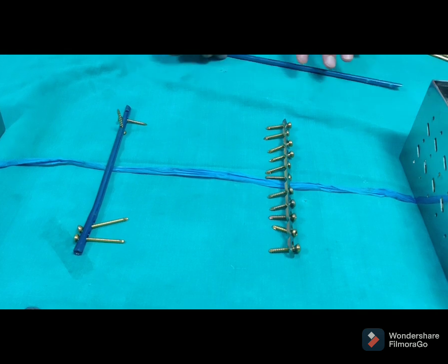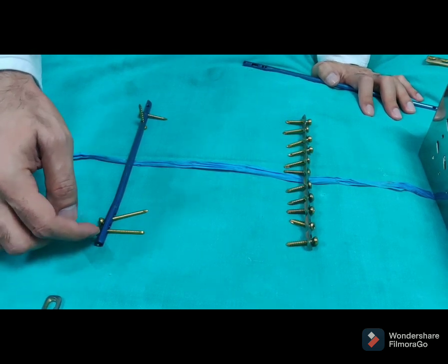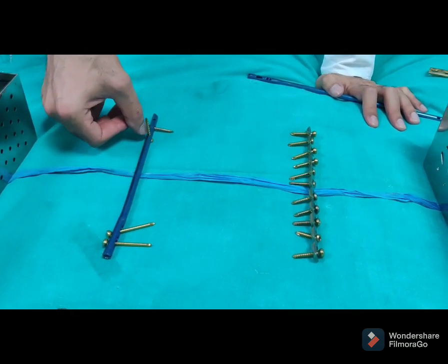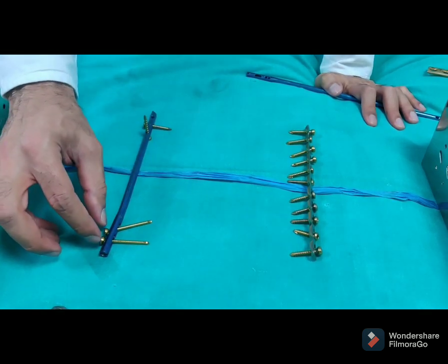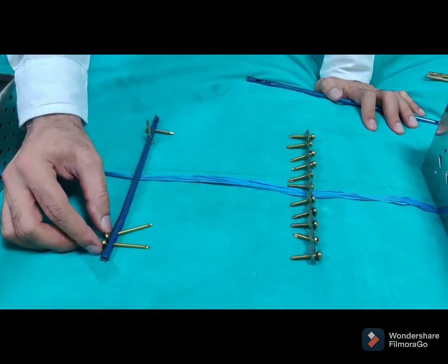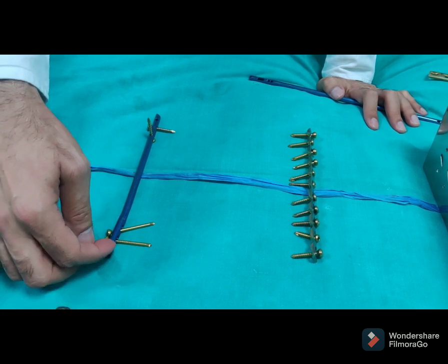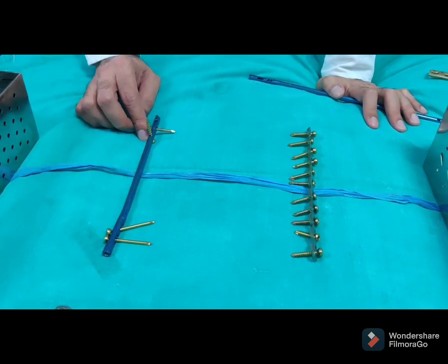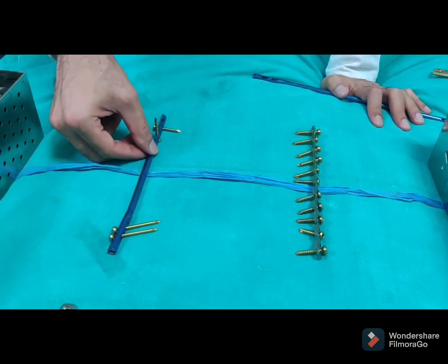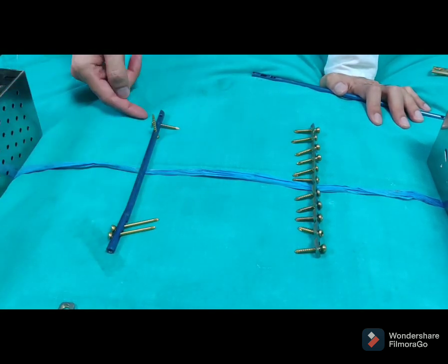Now let's talk about the nail. Where we put the nail at the shoulder, only a small incision is made, and the rod goes into the medullary cavity inside the bone. For fixation, only two screws are placed above and two screws below the fracture — all through small incisions. These incisions are so small. If needed, we can remove the implant easily, but most of the time we don't even need to remove it.